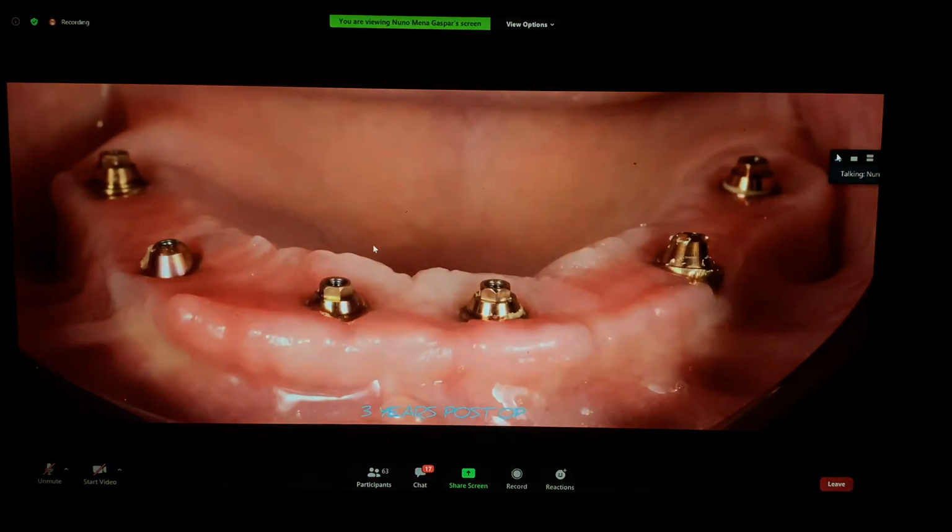And this is how it looked at 3 years follow-up. It's plain, or sometimes even like an ovate pontic. I clean this every 6 months, and I unscrew this kind of prosthesis once a year. This is how it looks a year after the last cleaning. It's quite good, and the tissues look healthy.